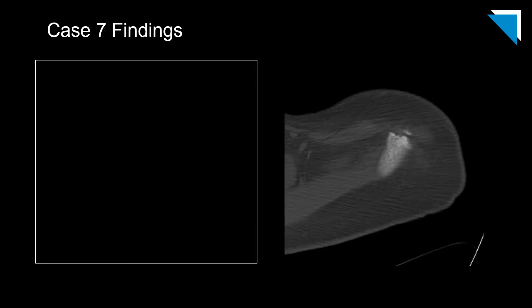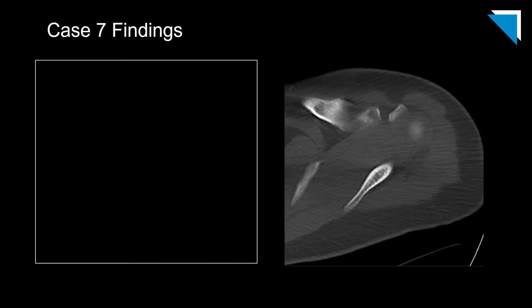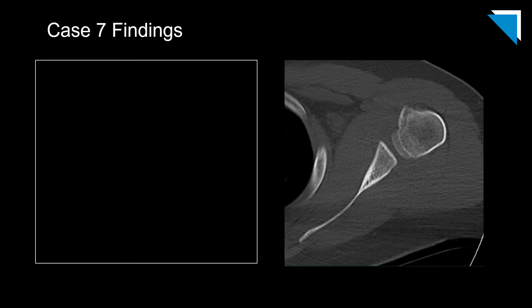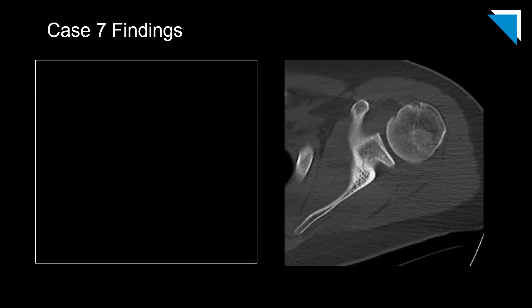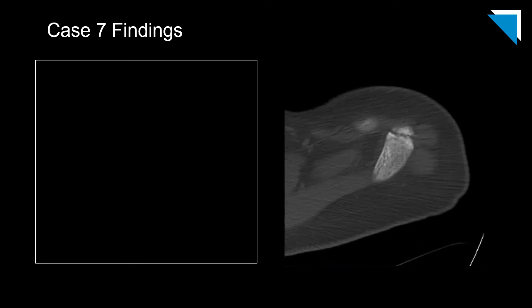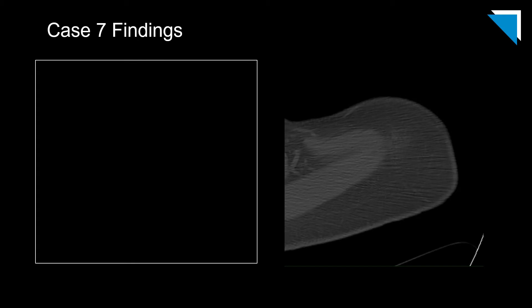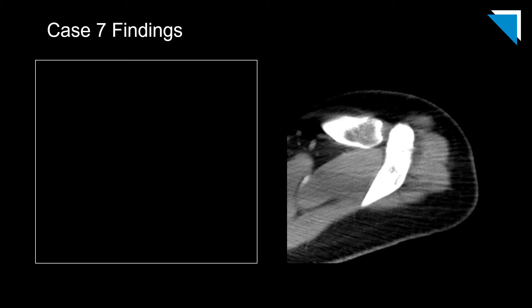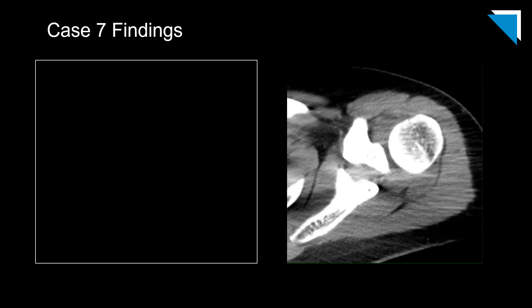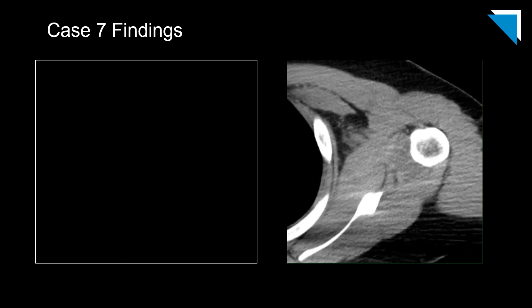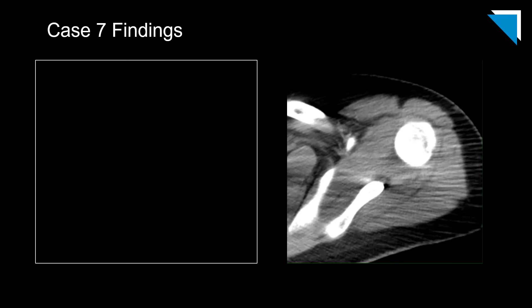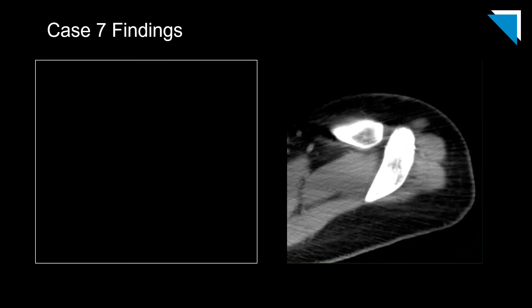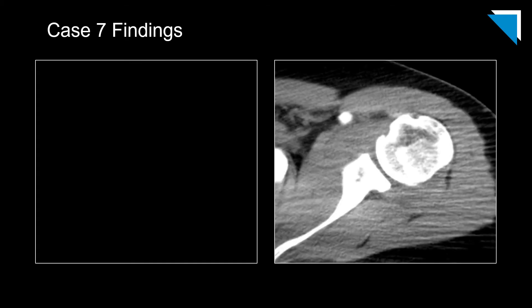Our next case is a 17-year-old boy with pain status post trauma. These are axial images from a CT scan of the shoulder. It's very important in musculoskeletal imaging to know the normal anatomy so you can look for abnormalities. In this case there is an os acromiale, a normal variant often mistaken for a fracture. Always remember to review the soft tissue windows, as findings there can draw your attention to osseous pathology you may have missed on the bone windows. There is a large lipohemarthrosis.